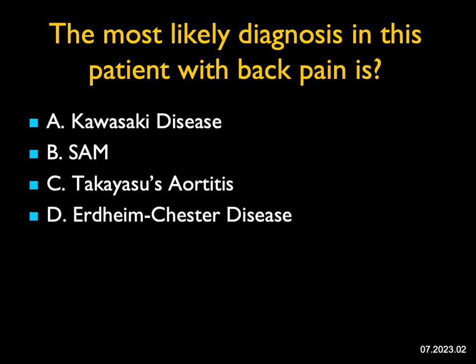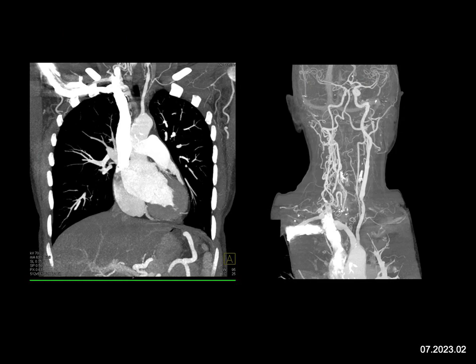The most likely diagnosis in this patient with back pain — we're looking at a CTA of the chest and a CTA of the head and neck region. When given the choices, we're thinking about some sort of vasculitis. Takayasu's aortitis is a large vessel disease, and the most commonly involved vessel is going to be the left subclavian. SAM typically involves the SMA or other mesenteric vessels. Kawasaki's disease — we typically think about the coronary arteries and coronary artery calcification.